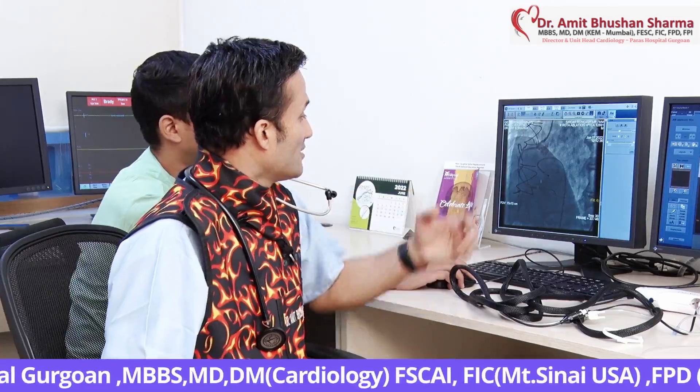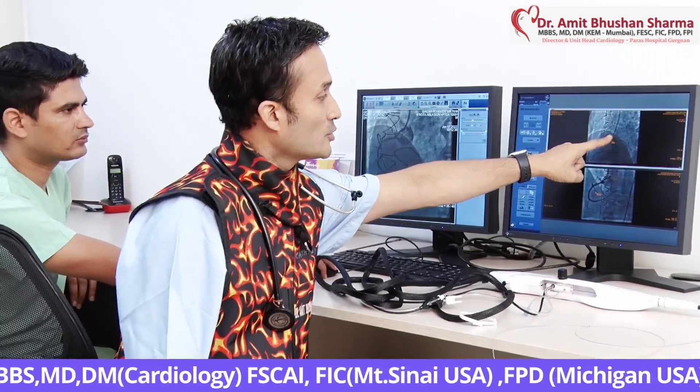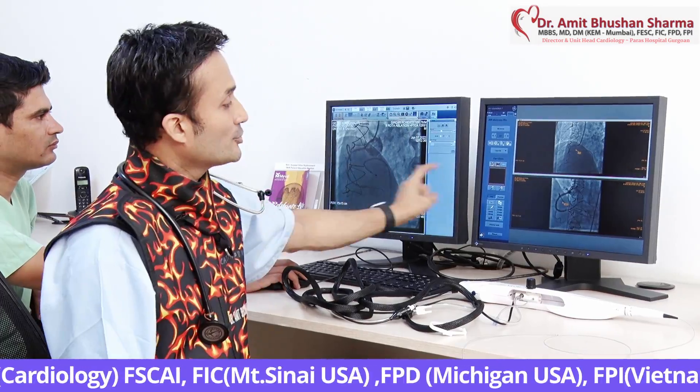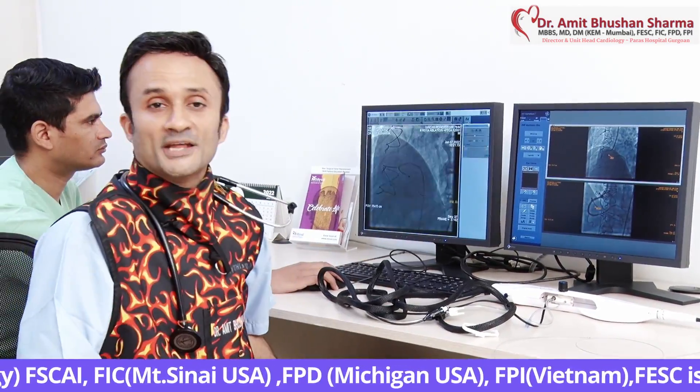This is a boon for diabetic patients and people who have heavily calcified arteries. Once we ended up putting multiple stents — if you see carefully, the earlier picture was totally blocked, and once the balloon was opened up, the final picture shows the RCA was totally opened up. It was a very heartening procedure.